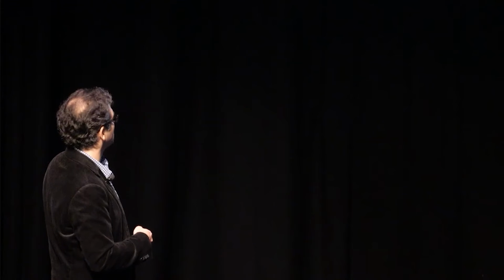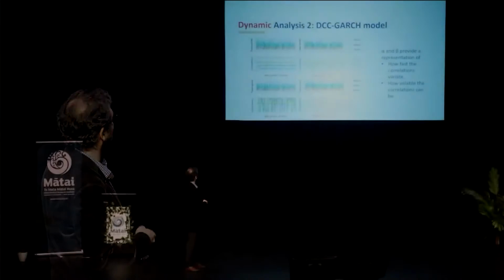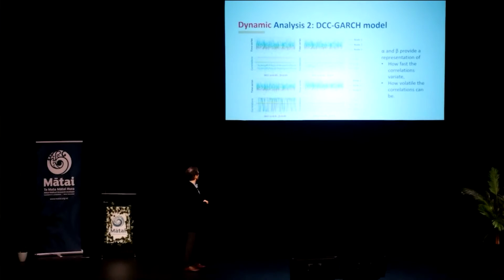Here it's pretty much constant, and here it's changing rapidly. So these four dynamic patterns are something that now, using this method, we can model. And this model has two parameters that we can use to characterize each of these patterns.